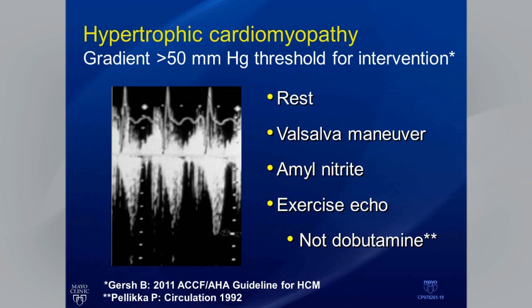We don't do dobutamine testing in these patients because dobutamine can produce an artificial obstruction even in patients without hypertrophic cardiomyopathy. So it's just not physiologic.